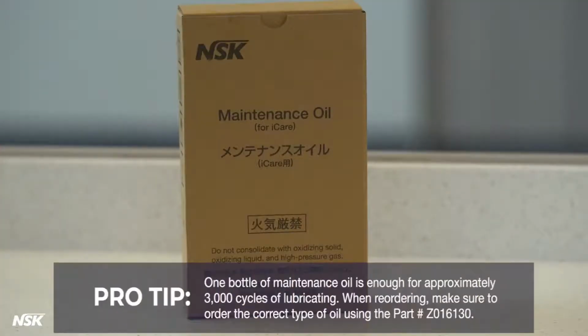Pro tip: 1 bottle of maintenance oil is enough for approximately 3,000 cycles of lubricating. When reordering, make sure to order the correct type of oil using the part number Z016130.